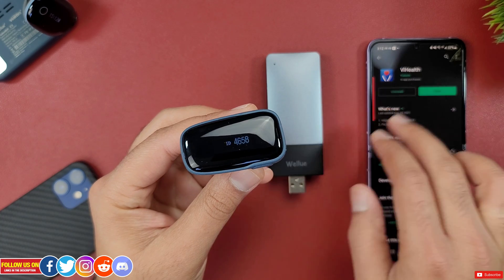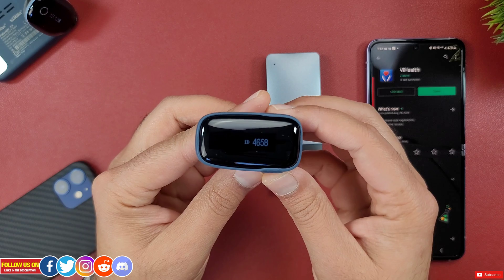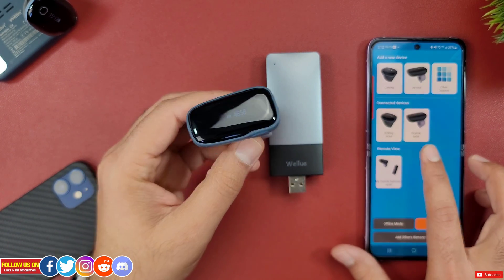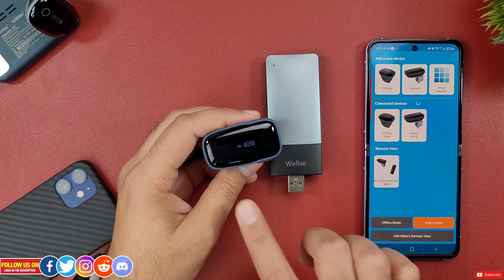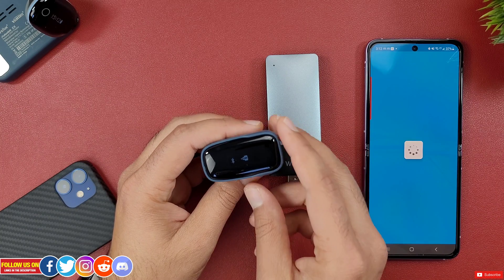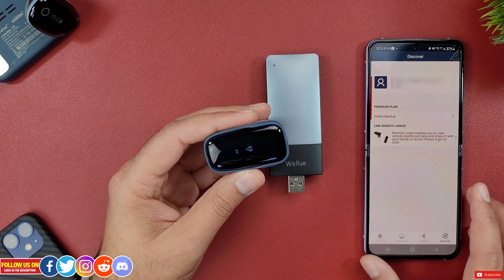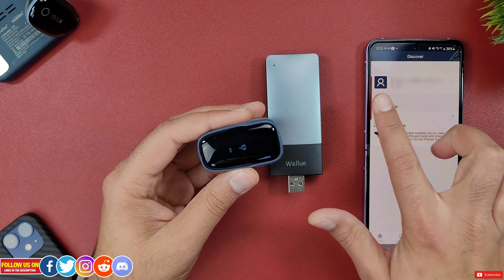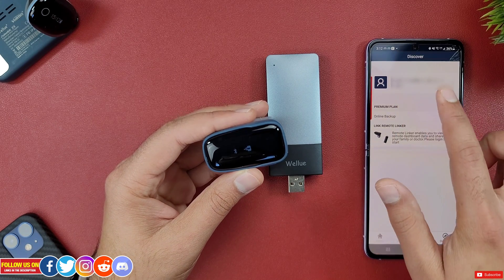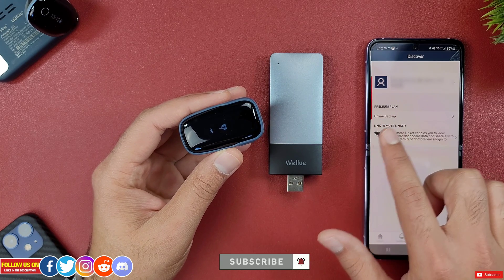For the setup process, start by downloading the V Health app, available for free on both the Apple App Store and Android Play Store. Turn on the OxaLink device and it should pop up in the app with a password displayed on the device — tap it to connect. Once connected, go to the Discovery tab. An important step: you must sign into the V Health app; if you don't have an account, create one before setting up the remote linker.